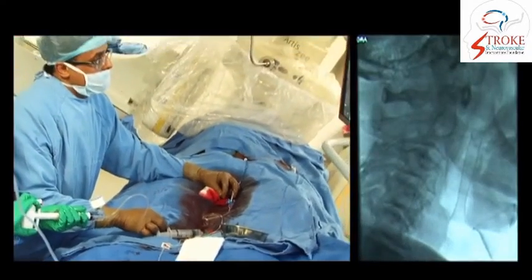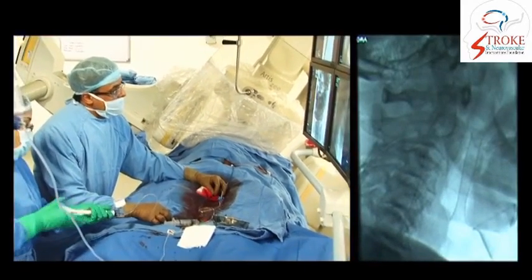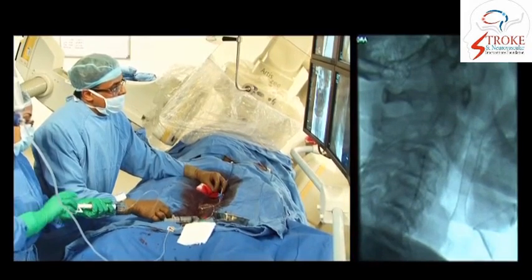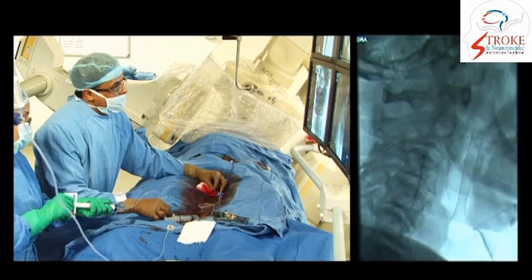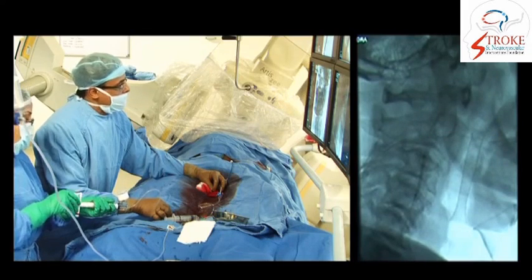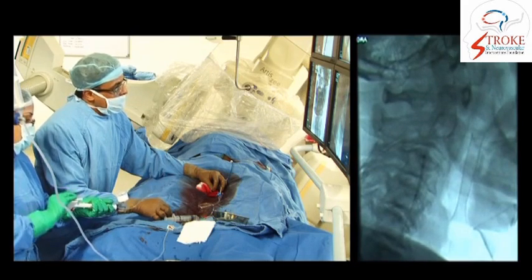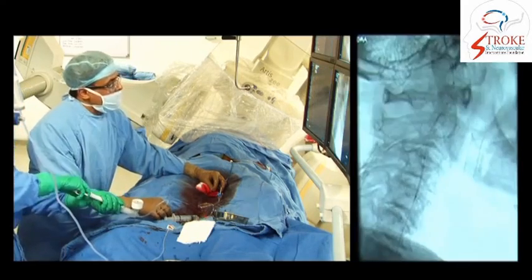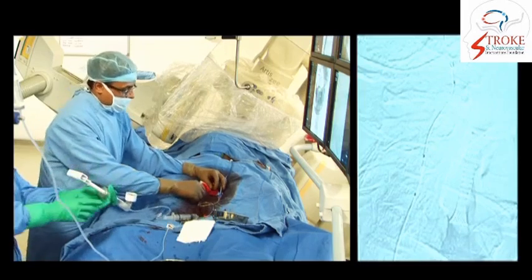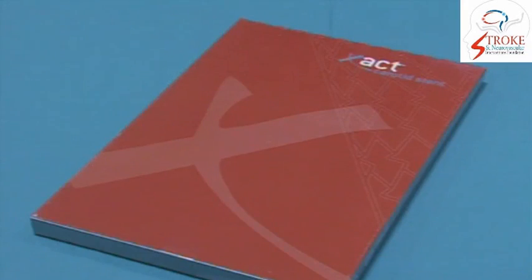The inflation is being performed and you can see, using our two hands, we try to keep the balloon stable at the site of the stenosis. So balloon inflation is done under fluoroscopy. You can see the balloon expanding. Now after this step, stent placement is to be done.